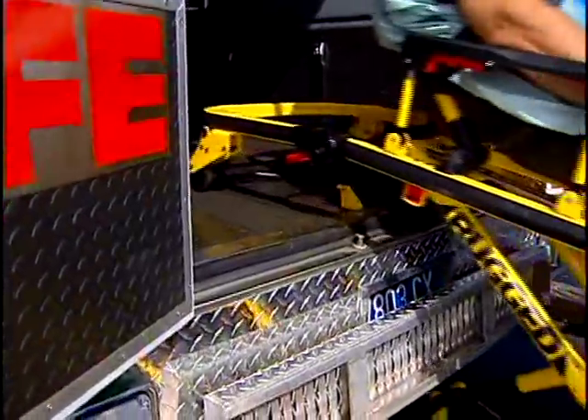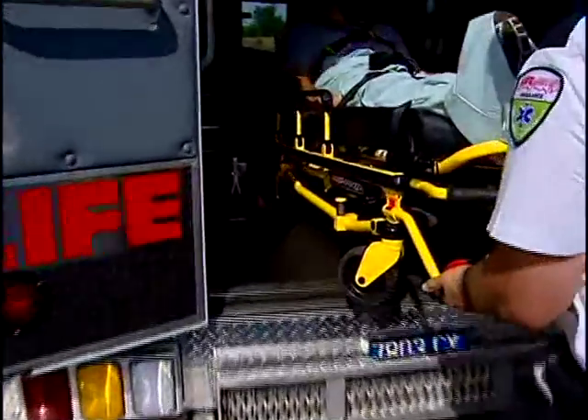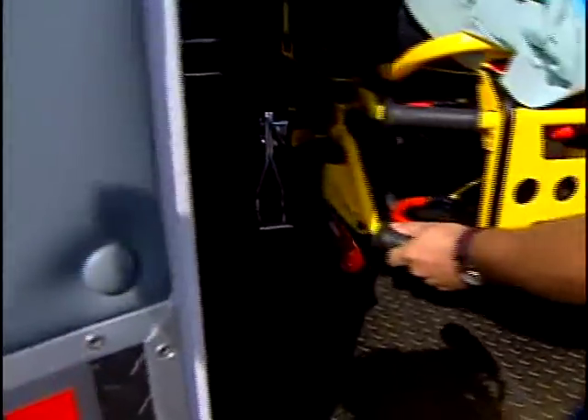To load a patient, approach the ambulance squarely, then pull the cot back enough to engage the hook, and squeeze the release handle as your partner folds the legs, helps guide the cot into the ambulance, and secure it in the cot fastener.